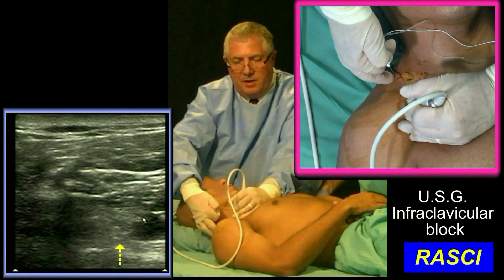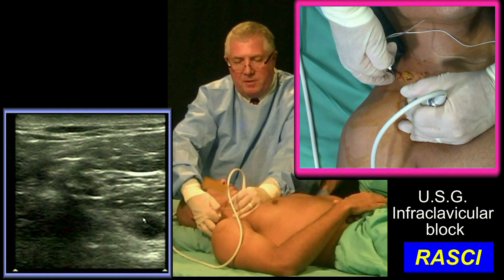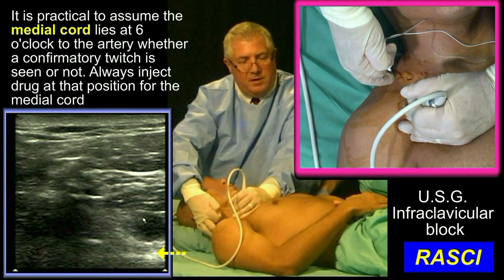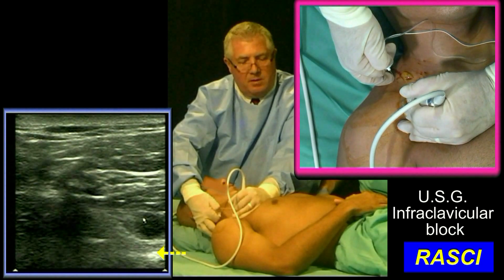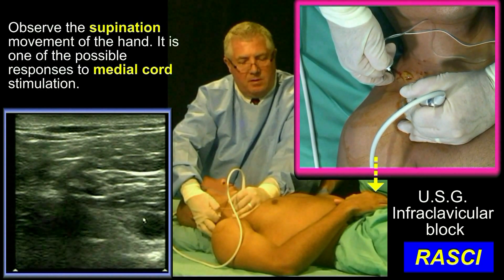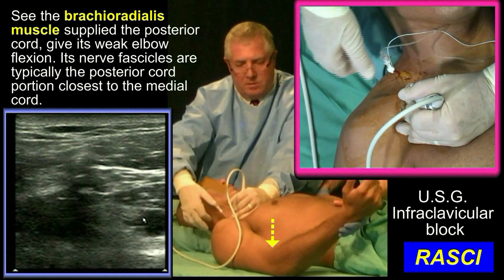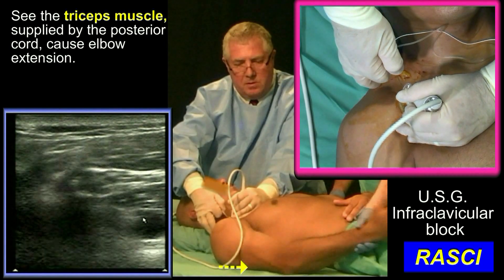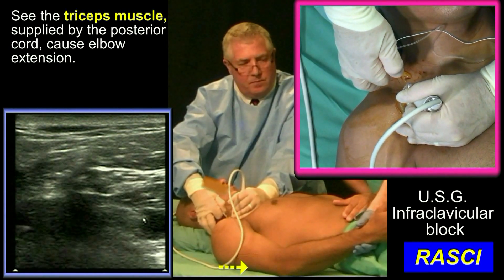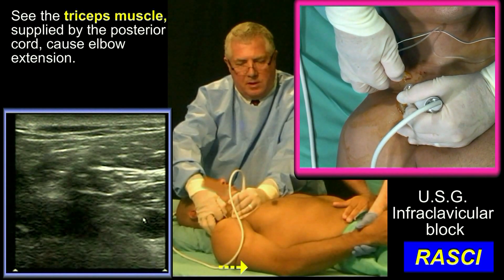I'm going to now advance the needle to 6 o'clock, just under the artery. You can switch on the stimulator. He may get an ulnar twitch. See the hand supinate, indicating medial cord stimulation. See the brachioradialis muscle twitch, indicating posterior cord stimulation. He's posterior cord all the way. I would at this point inject 5 milliliters.